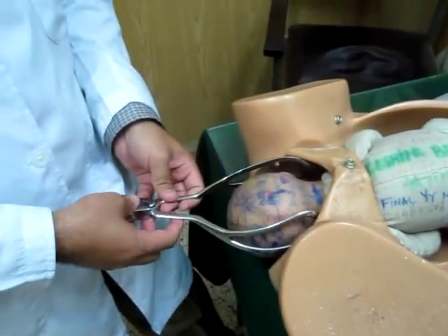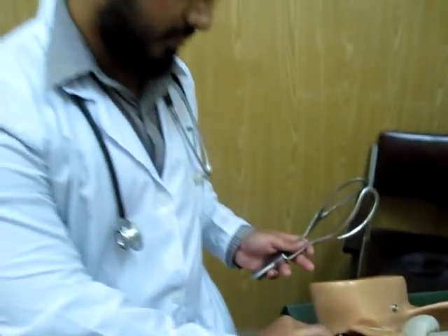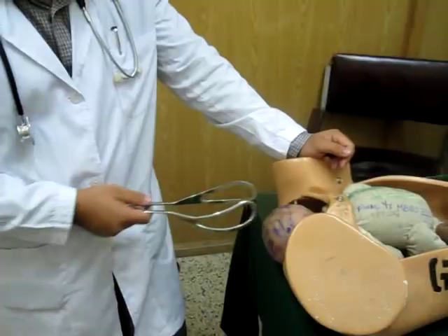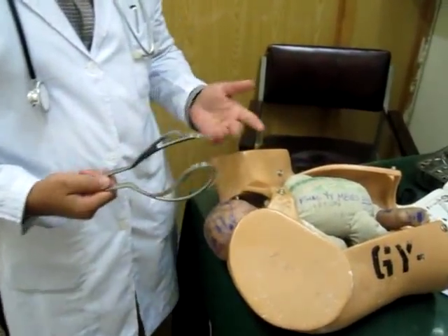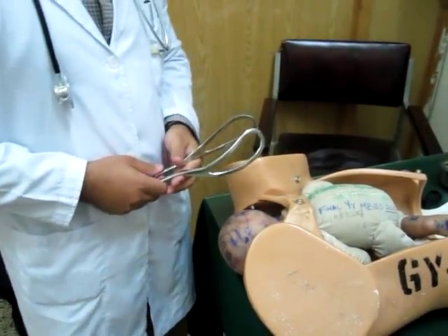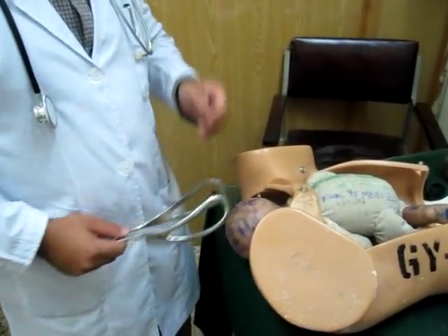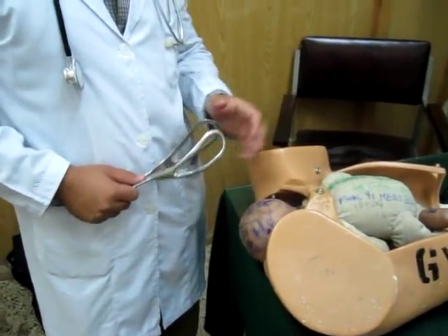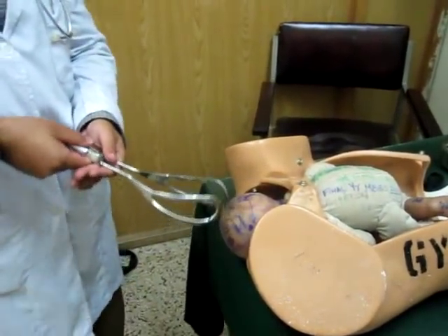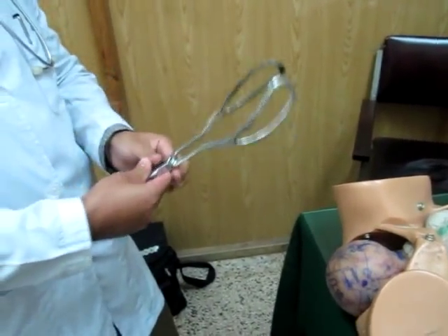These are the Wrigley's forceps. The complications include trauma to the scalp on both sides where the blades are applied. Because the instrument is metal, insertion can cause tears in the perineum, though if everything is handled carefully the damage may be minimal. It can also cause injury to the facial nerve, but this may correct itself within 24 to 48 hours. To summarize: the correct position has the dip upward, the blades going down on both sides, and locked.